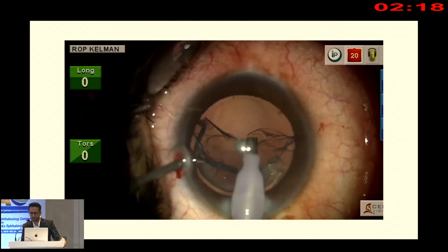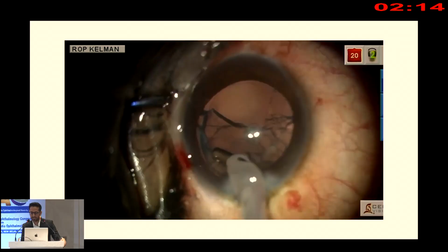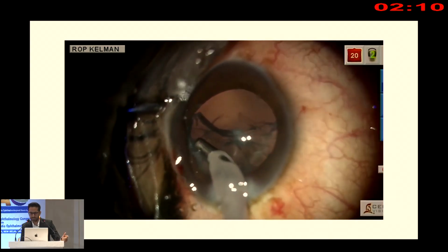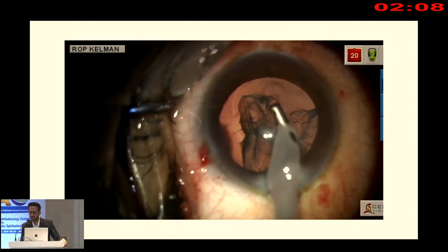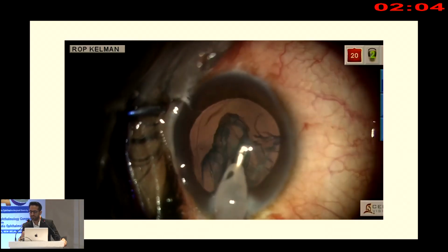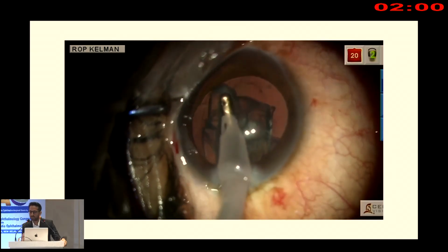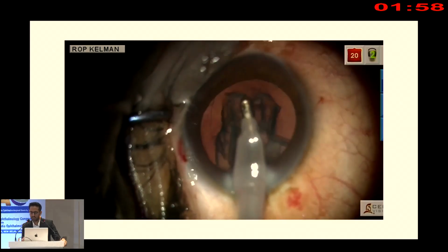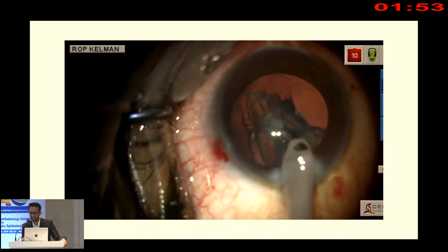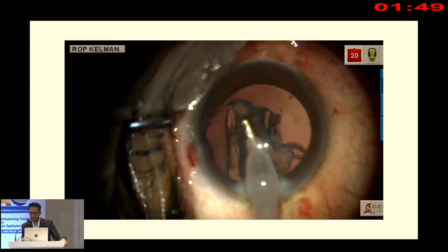So with the escape route, always remember to inject viscoelastic before taking out the probe. Bimanual IA could have been done, so what I do is a high sleeve retraction of coaxial IA, so that it gives you a different level of irrigation and aspiration, which simulates a bimanual IA. So now the epinucleus is taken out from all the ends.